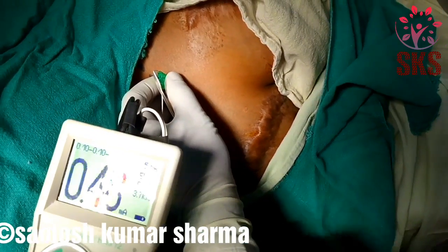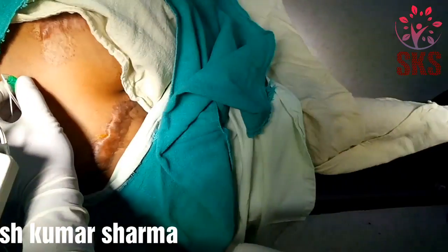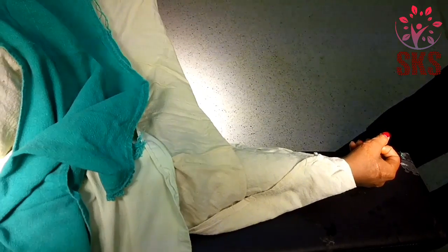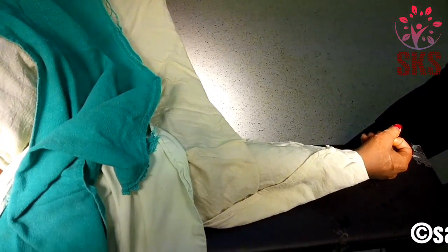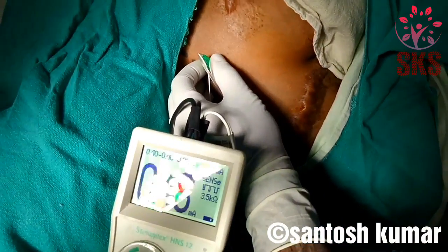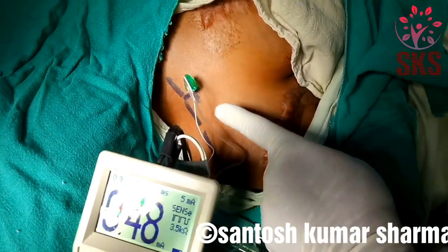Now I will inject the drug. Just 1ml inject. I have injected and it has disappeared — this is called a positive Raj test, at 0.48. I have injected the drug. See the needle final position.